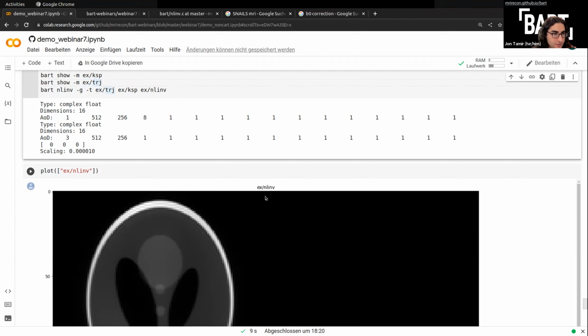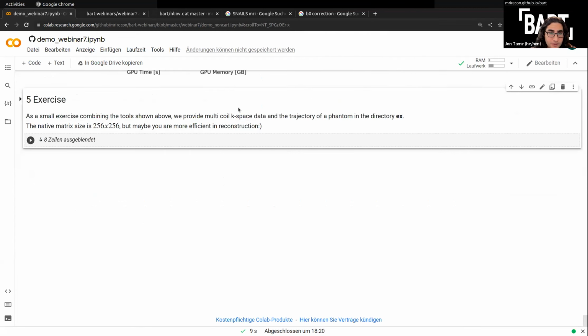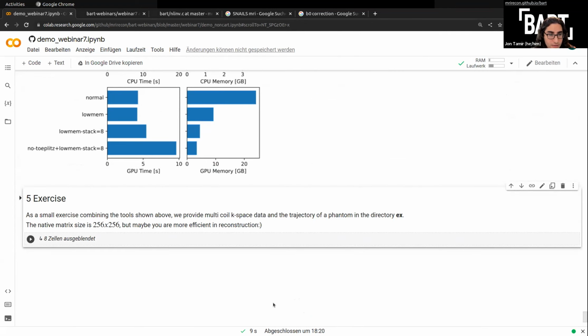Thanks very much to both of you. I think this is a really nice addition to some of the non-Cartesian webinars we've done in the past. In past webinars we've gone over non-Cartesian reconstructions, but on a higher level. This is a really nice deep dive, and especially this last part: you get a great factor of savings in memory for a small cost in time. It's really worth experimenting with that, especially for 3D data. I think that will help a lot.